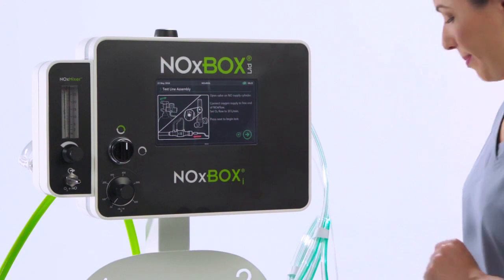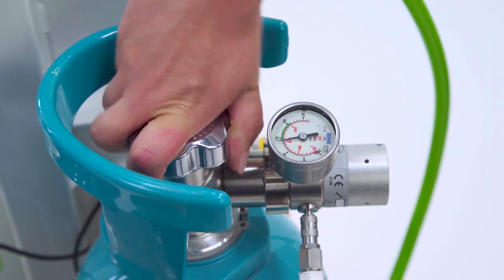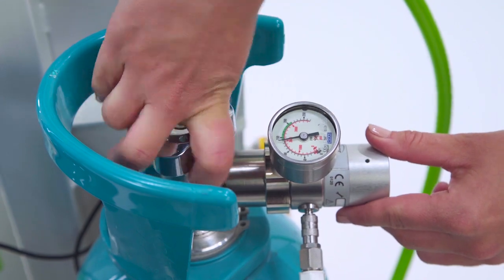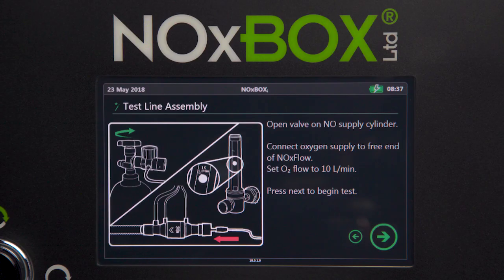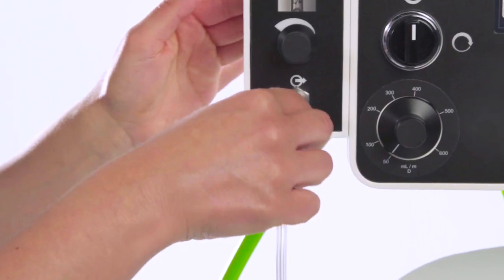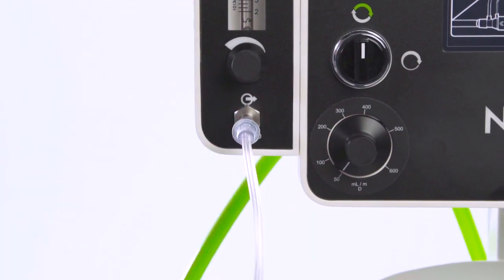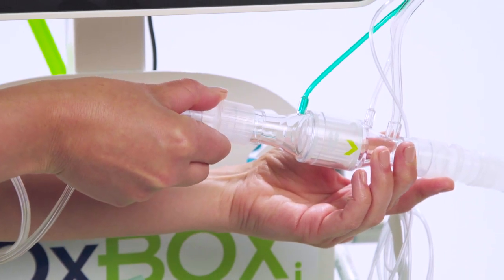Now open the NOxEvent nitric oxide gas cylinder, which has remained closed during the leak test performed earlier. If you are using 2 cylinders, open them both at this time. Connect 10 liters per minute of 100% oxygen to the NOx flow using the test kit tubing. The NOx mixer can be used to supply 100% oxygen for this purpose. Simply connect one end of the tubing to the NOx mixer outlet, and the other to the open end of the NOx flow as illustrated on the display.